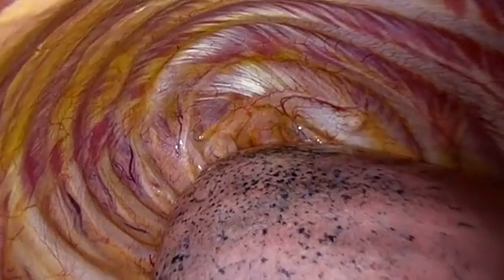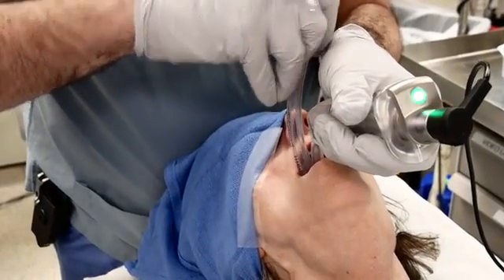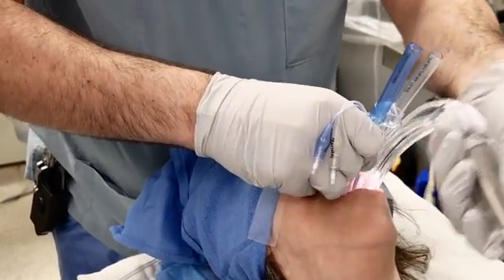In this video, we have reviewed the basics of double-lumen endotracheal tubes including indications and contraindications. We have also demonstrated the technique for insertion and discussed possible complications.